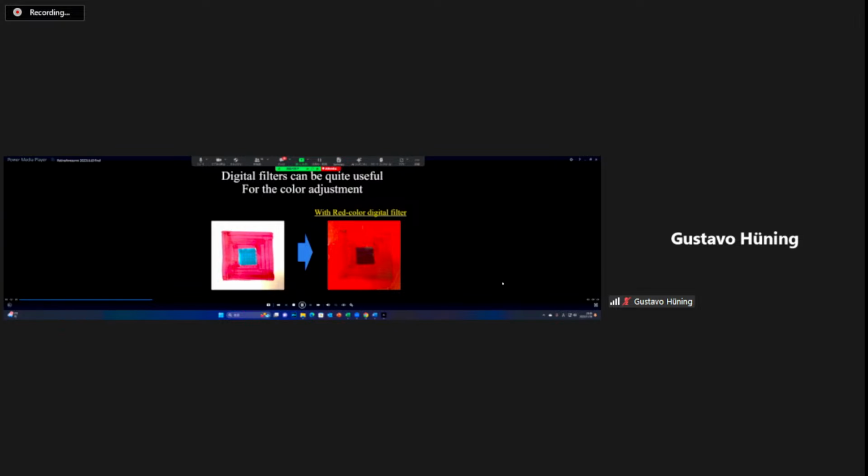Think of digital filters as applying a colored transparent layer over the surgical view. For example, placing a red filter on red text makes the text blend into the background. Conversely, if you overlay that red filter on green text, the opposite effect occurs. The green turns black. This simple concept is essential for enhancing the visibility of a specific target tissue.